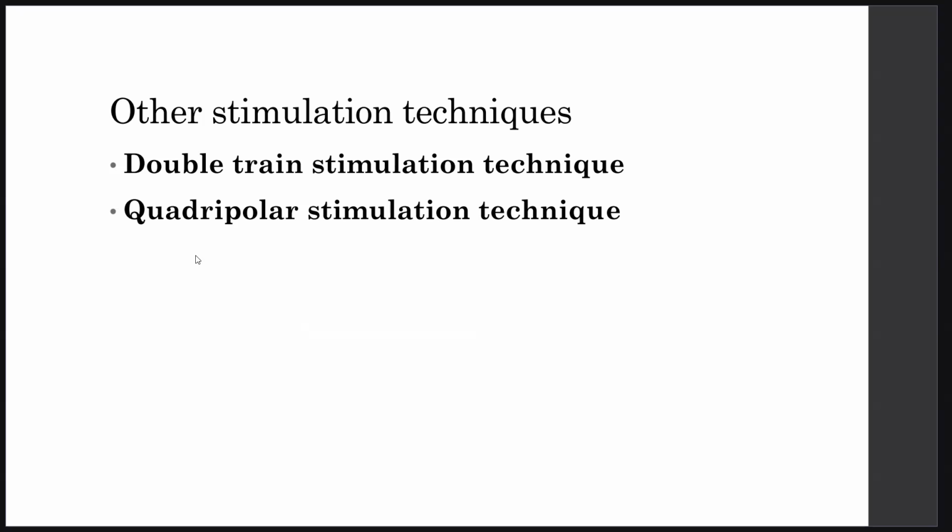There is another type which is called quadrupolar stimulation. Quadrupolar stimulation is when you get the benefit of the spatial summation character of the cortical neuron excitation. You will stimulate by 2 active electrodes, cathode and anode, so you are stimulating a larger area of motor neurons. These are also techniques that can be used in patients with neuromuscular diseases and patients who have difficulty in attaining motor evoked potentials, but they are not pre-op. They have pre-op abnormalities. You can use these techniques.